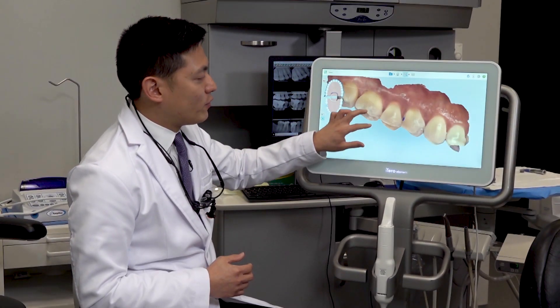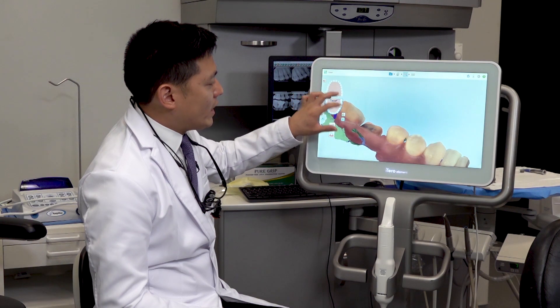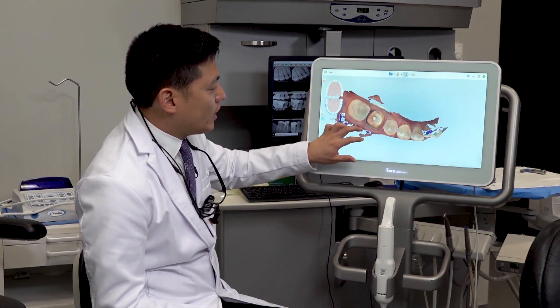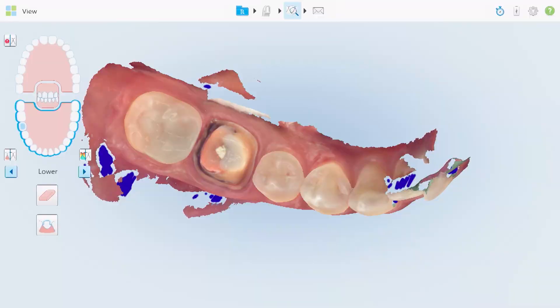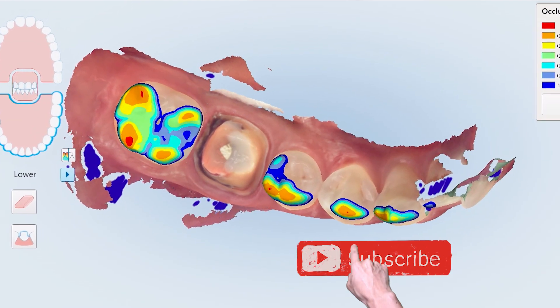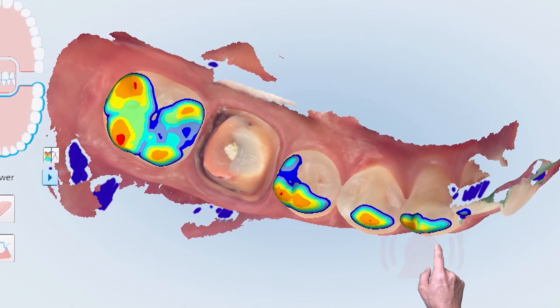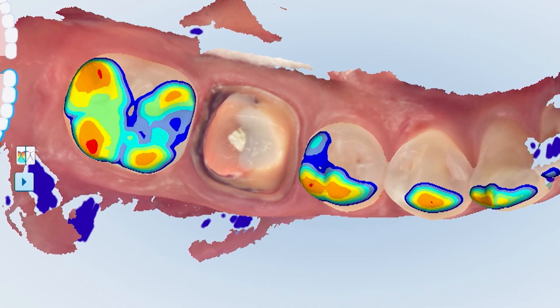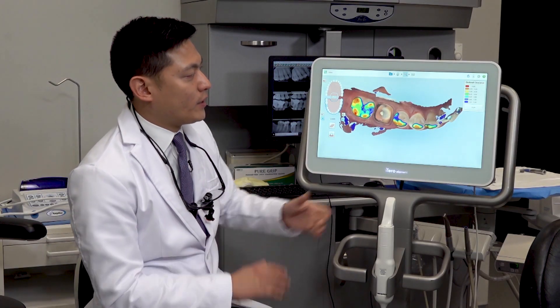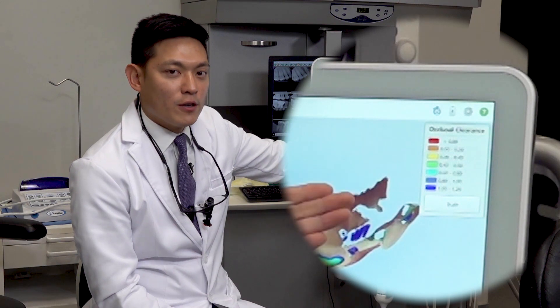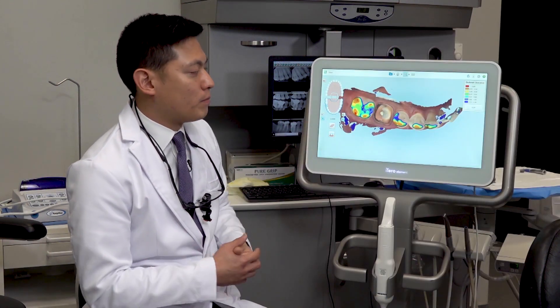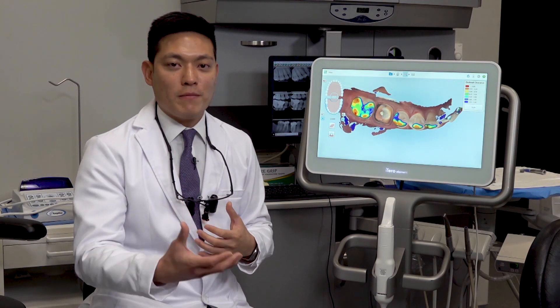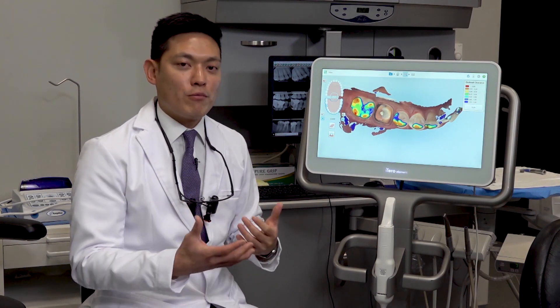Once you analyze that information, many of the scanners today have some additional features. In this case, the iTero Element has an occlusal clearance function. When I activate that occlusal clearance function, we can see some areas here that have a color map. It will reveal on the preparation how close it is or how far away from the opposing that prep is.